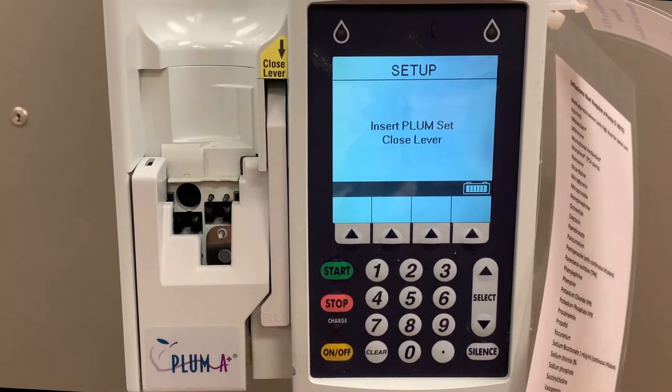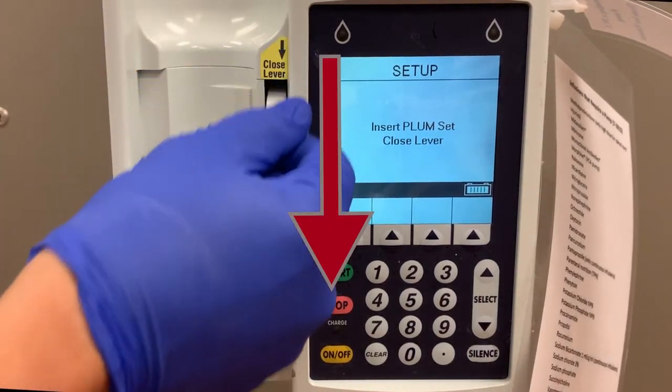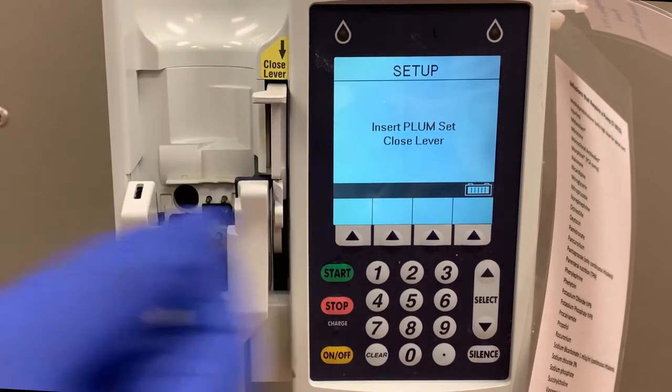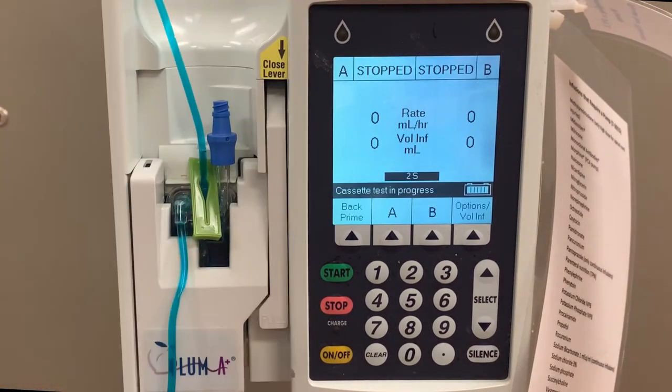You will be prompted to place the tubing cassette primed with your medication into the pump. You can open the door by pulling the lever up and closing it by pushing it back down. Open the door and place the cassette into position. The pump will run a self-check, and as this happens it will say cassette test in progress on the screen.